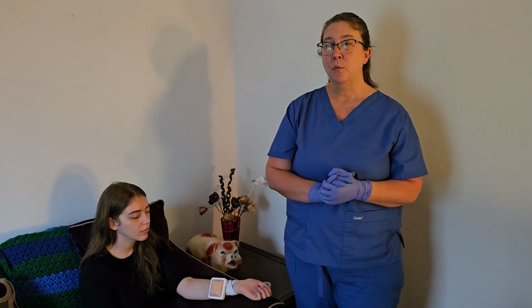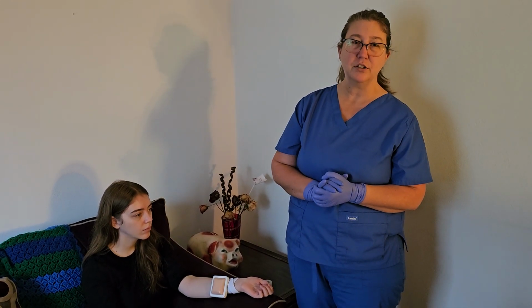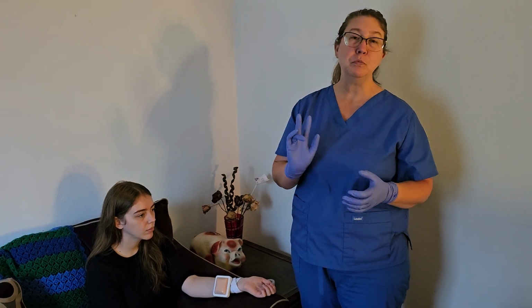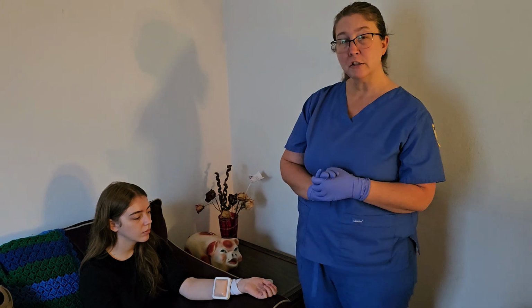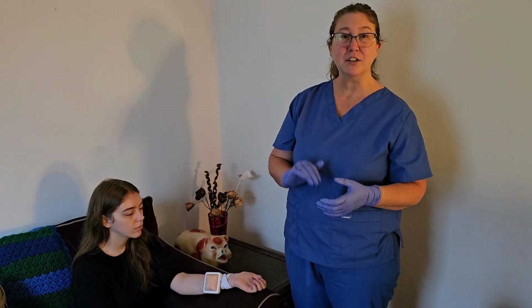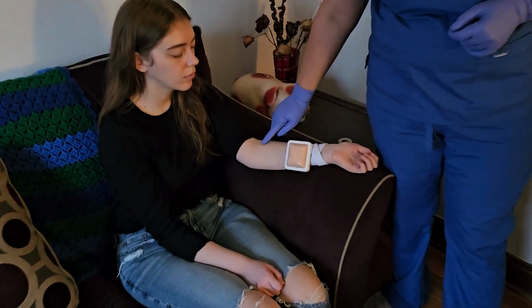Now, with an intradermal injection, we are going to inject the medication just under the skin, and there are 2 places where it's best for that. The first place is the inner aspect of the forearm, which is right here.